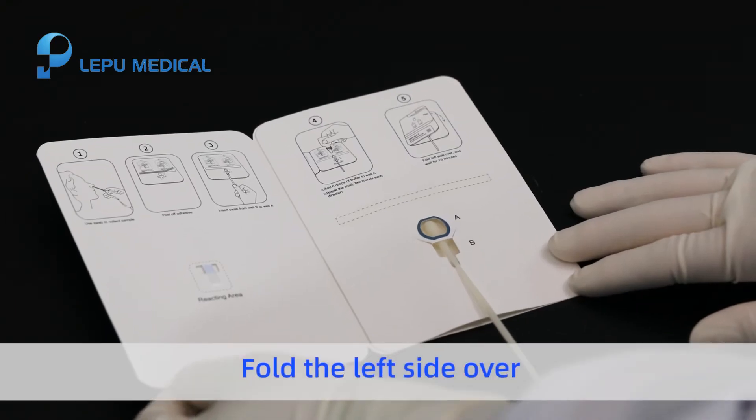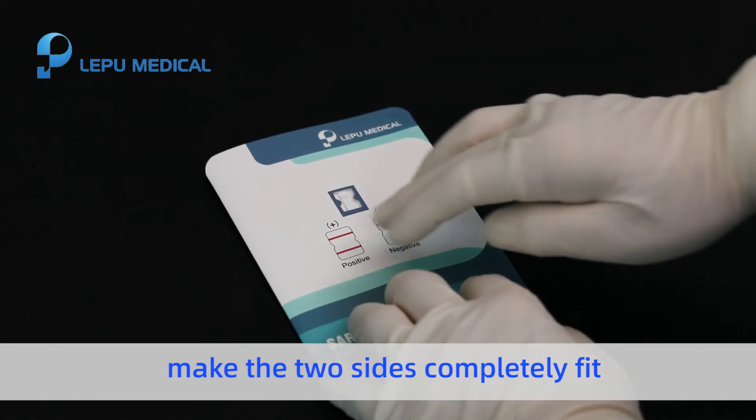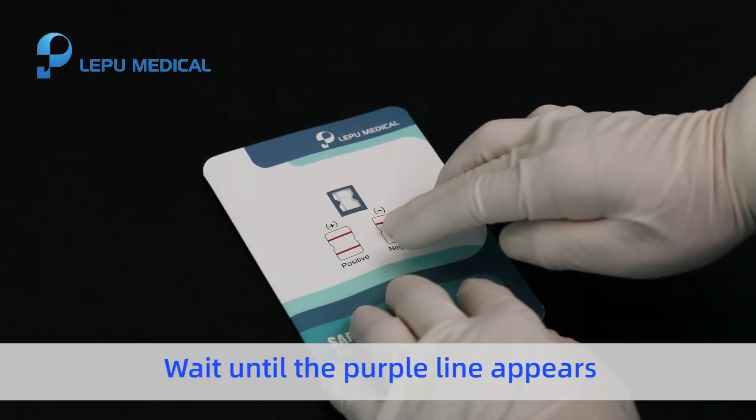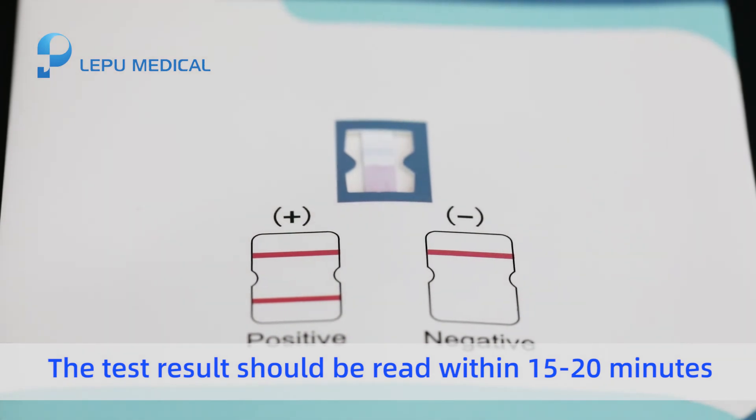Fold the left side over. Gently press the adhesive position to make the two sides completely fit and start timing. Wait until the purple line appears. The test result should be read within 15 to 20 minutes.